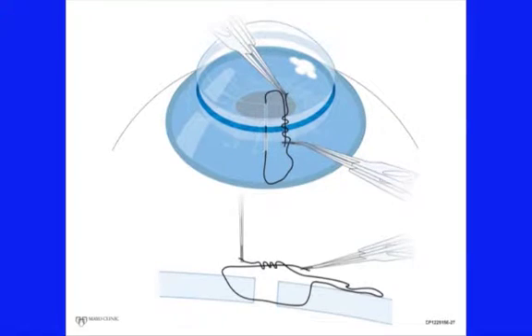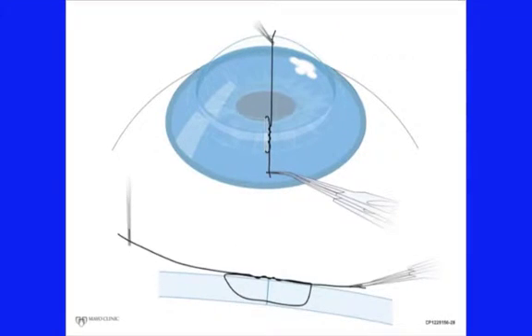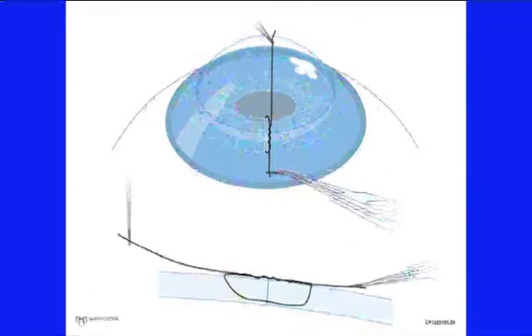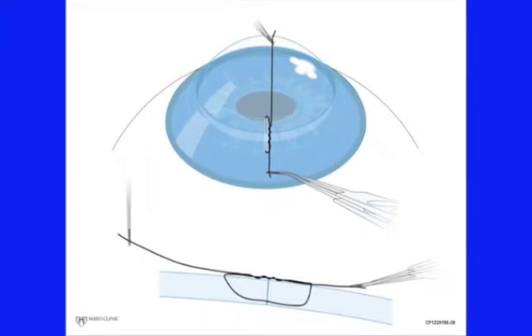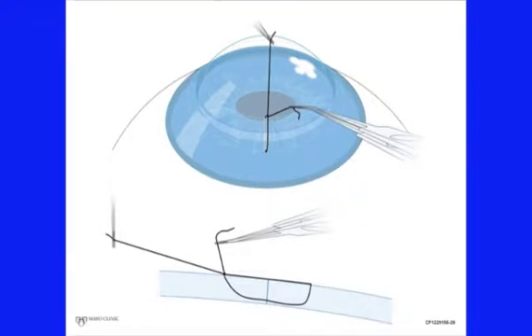Then move the short suture towards the host side of the wound. Do it on a line parallel to the suture that is through the graft host interface. And pull gently so there's still slack in the system. And now make a series of stop and go tugs that pull the same amount on the short and long suture. In between tugs, observe the wound edge to see if it is starting to compress. When the wound shows the compression you want, put mild tension on the long suture.